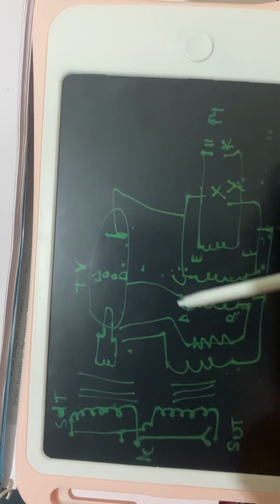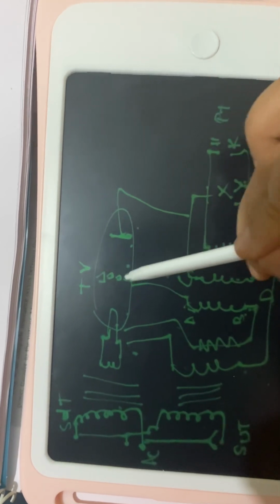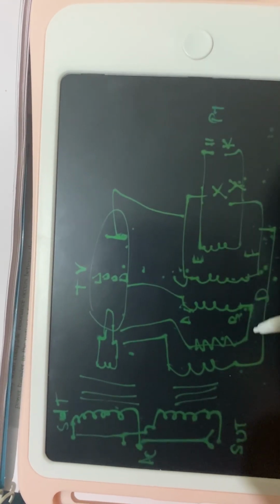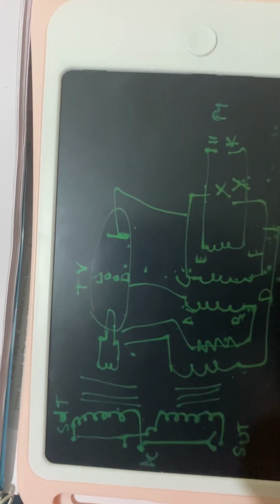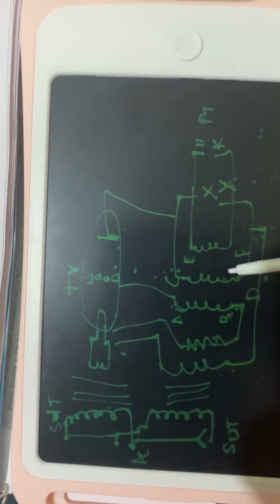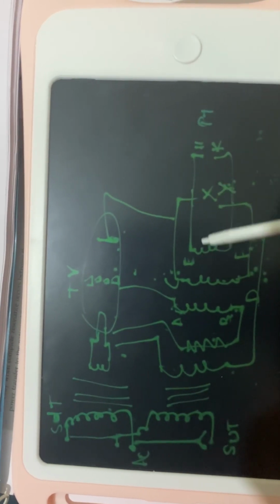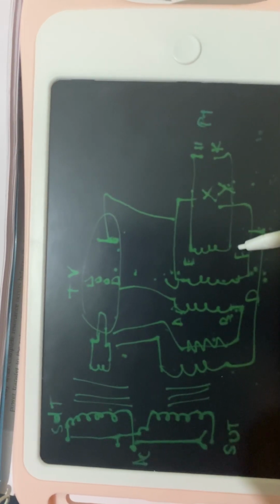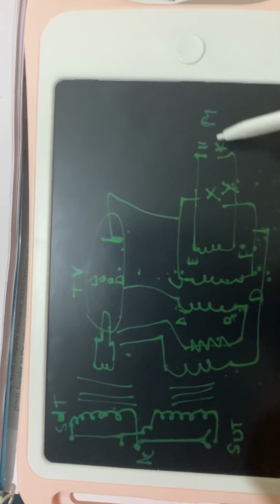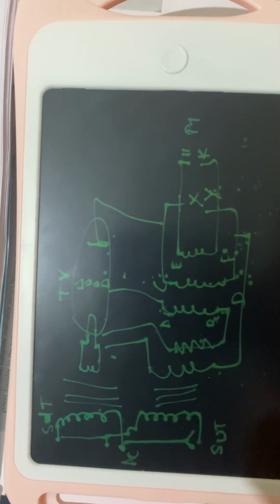When this current flows, there is some current which is stuck in the grid. So this grid leak is present to carry this current back to the filament. When current is induced in CD, there will be resonating current in EF, which is the patient circuit. When EF has the current, it is passed through the patient circuit. This is about the working of shortwave diathermy.